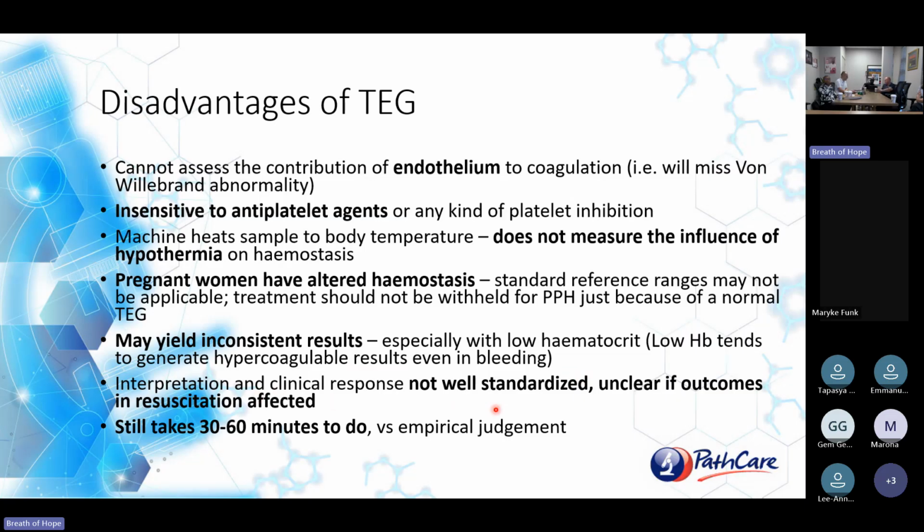Interpretation of the TEG is not well standardized, and it's unclear if resuscitation outcomes are affected. Yes, we give fewer blood products, but do we actually save lives?